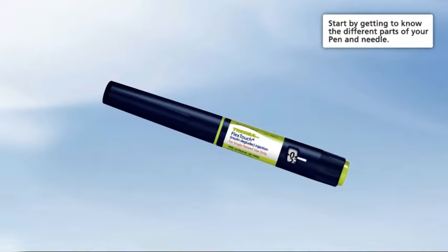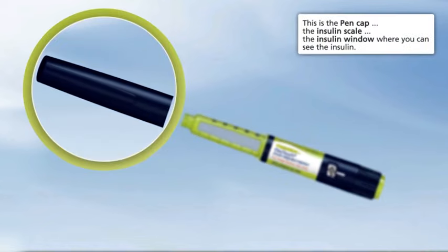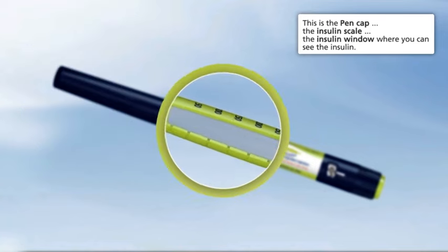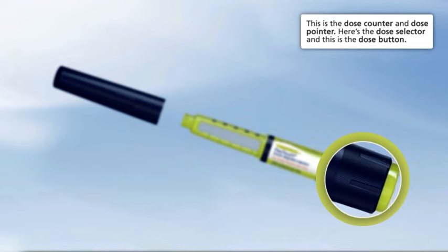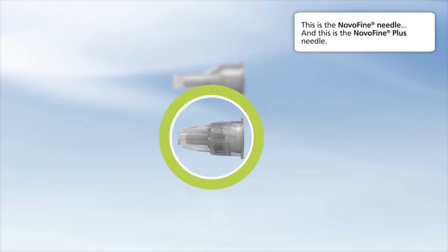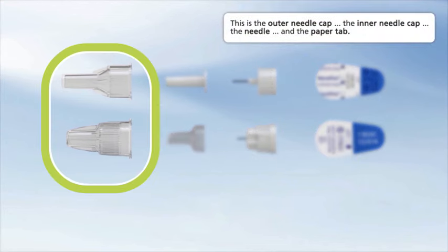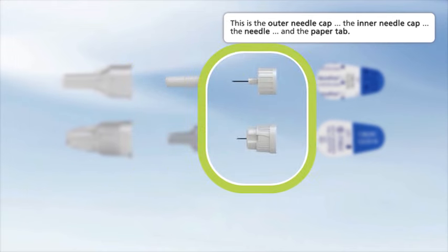Start by getting to know the different parts of your pen and needle. This is the pen cap, the insulin scale, and the insulin window where you can see the insulin. This is the dose counter and dose pointer. Here's the dose selector, and this is the dose button. This is the NovoFine Needle and the NovoFine Plus Needle. This is the outer needle cap, the inner needle cap, the needle, and the paper tab.